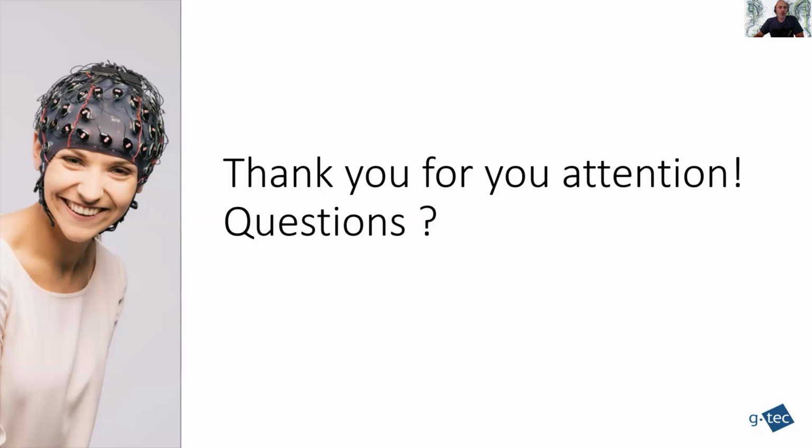Chandra wants to know, what's the minimum number of EEG channels to get sufficiently good results? It depends on your application. I would say starting with 8 for an ERP and starting with 16 or 32 for an MI experiment.